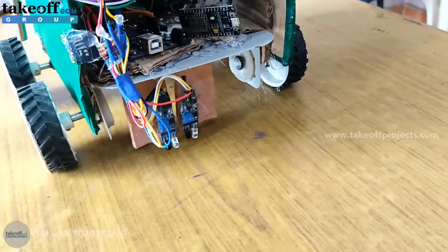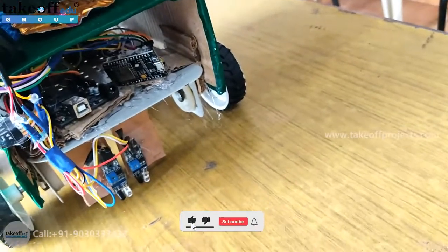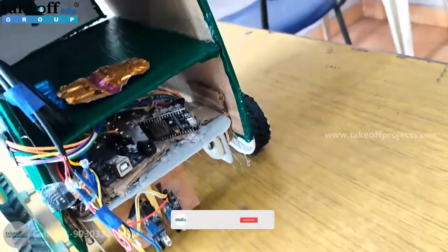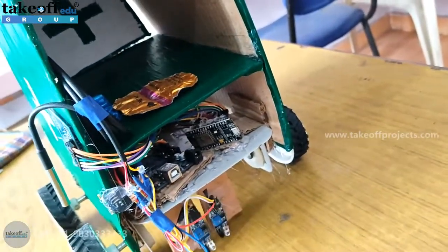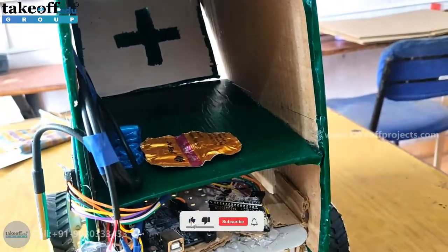The width of that black line should be in between these two IR sensors — then only it will navigate perfectly. And here is a compartment for putting all the tablets for patients.